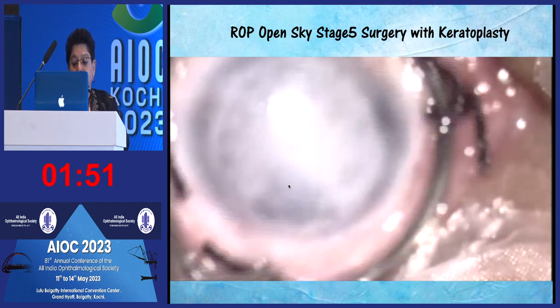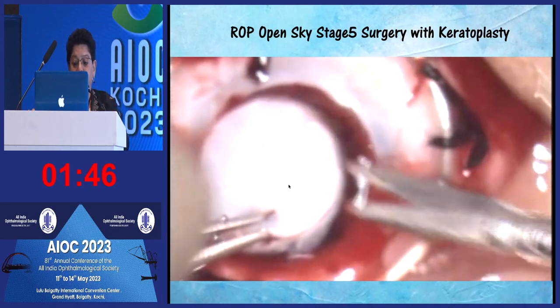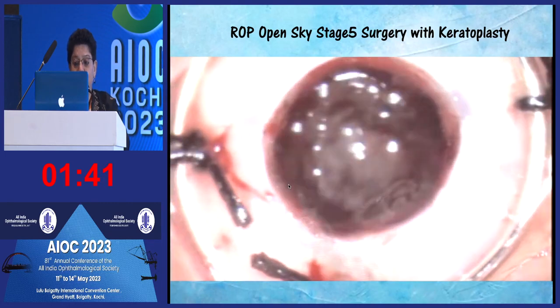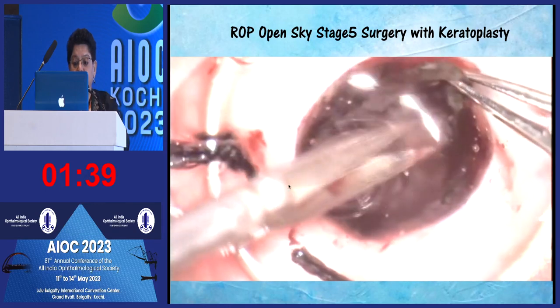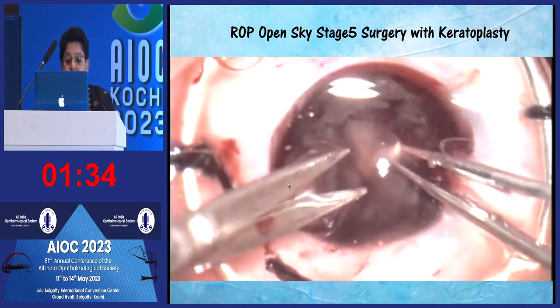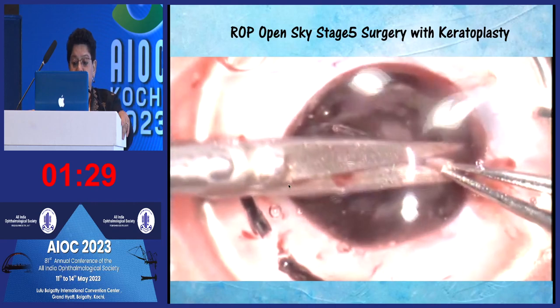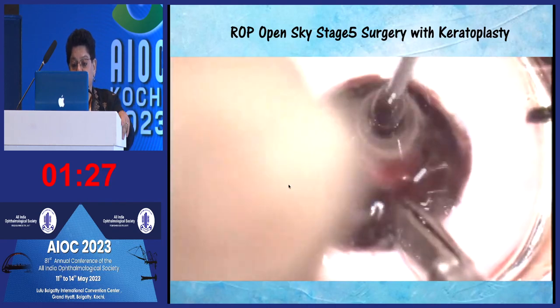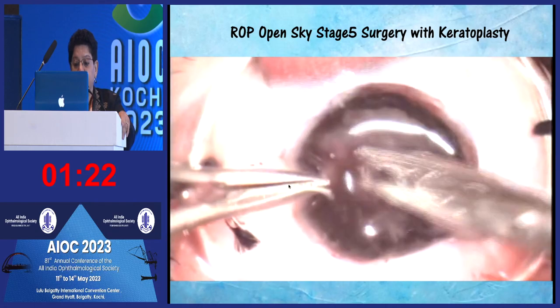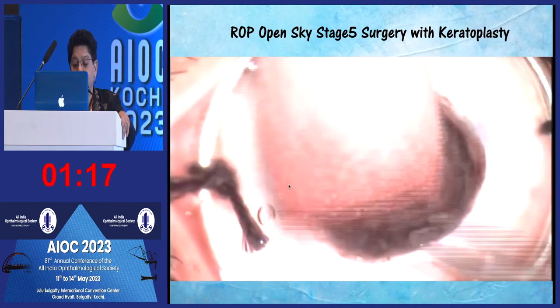So that is a Flieringa ring which has been put, and then you see how thick the cornea is and separated from the iris, and the lens has been removed. And there you see the dissection of the fibrovascular tissue from the retina. The whitish appearing substances are the fibrovascular tissues.